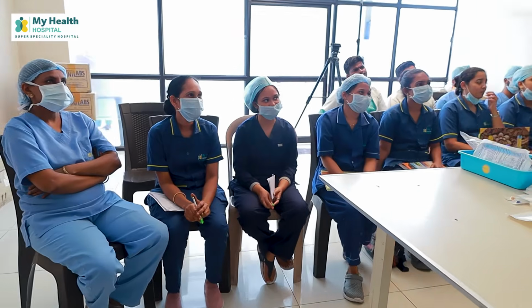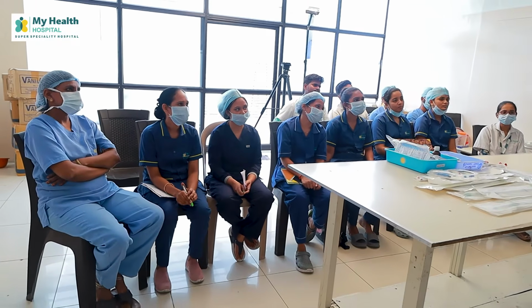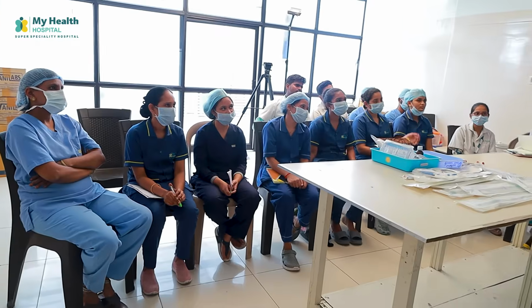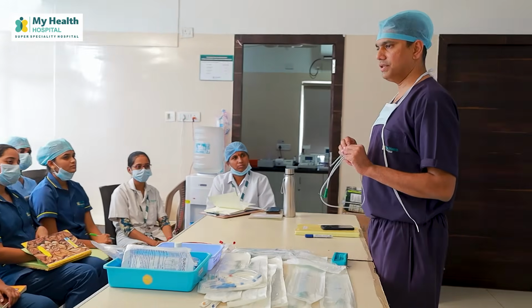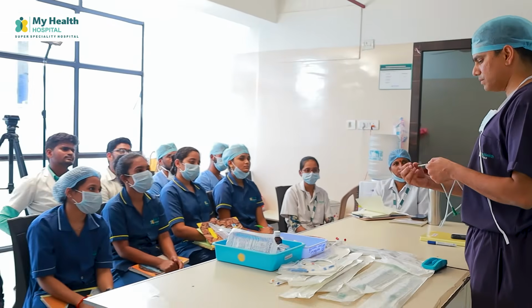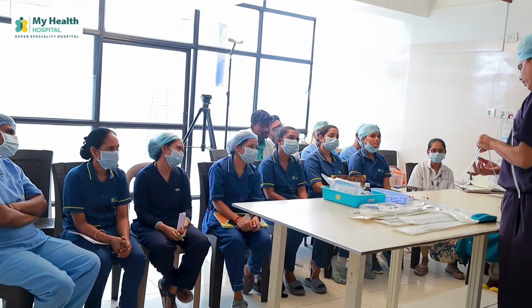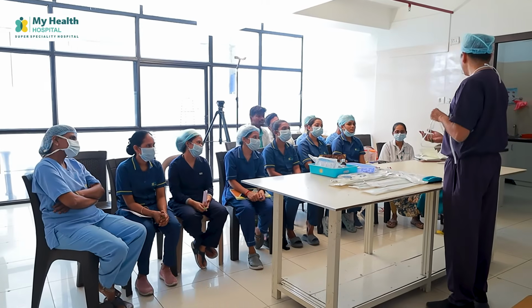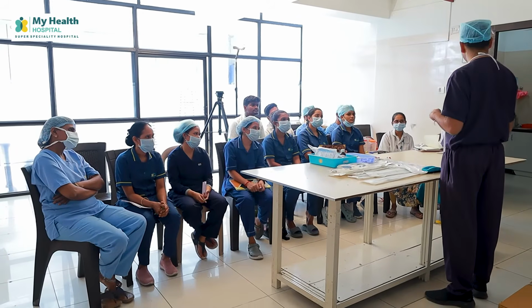See, in suction, the tip is open. When you connect it to a suction machine, it sucks the stomach mucus or whatever mucus plug is there. When you do suction, where do we suction? Oral secretions and laryngeal airway obstructions, there we do suction. So when we do that, we need an end-point suction, not at the edges. For effective suction, if some mucus plug is there, we need the impact here. We don't want it here, because it won't catch until all the holes are inside. The Ryle's tube can't do effective suction.